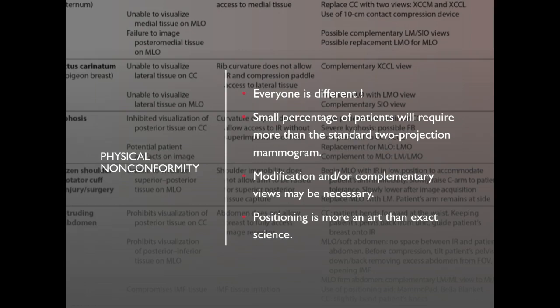And just keep in mind that positioning is more of an art than an exact science. Understanding how mammography works, understanding the history of mammography, the equipment and so forth is the science. Positioning is more of an art.